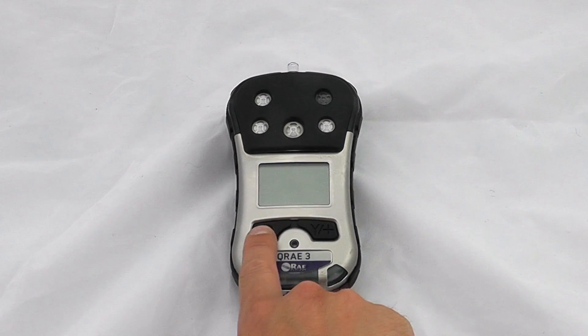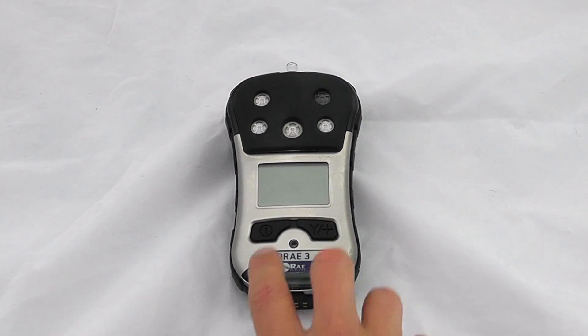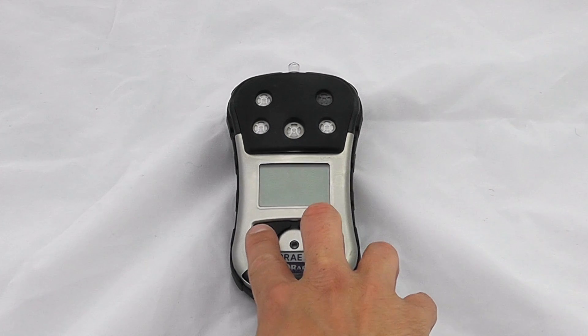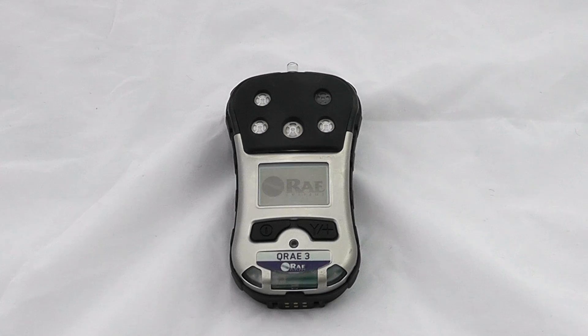We've got two buttons of operation on here: the on/off button or the mode button, and the yes, accept, or acknowledge button. To turn the instrument on, hold down the on button and it will go for a standard instrument startup.